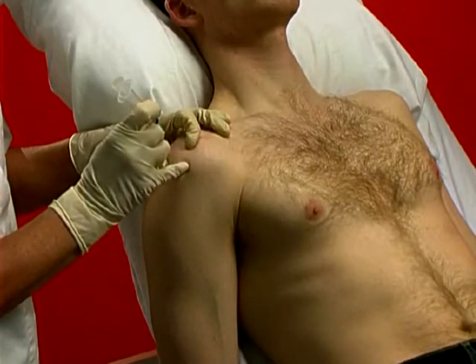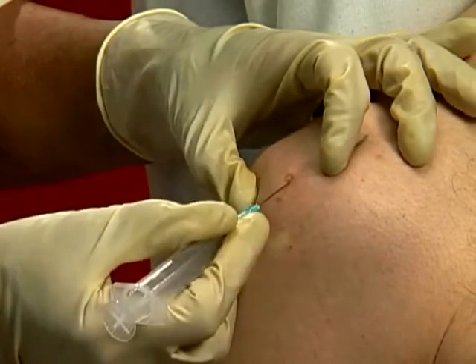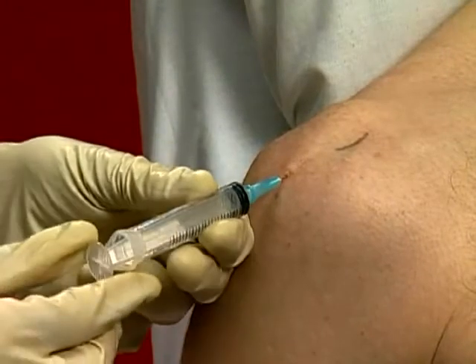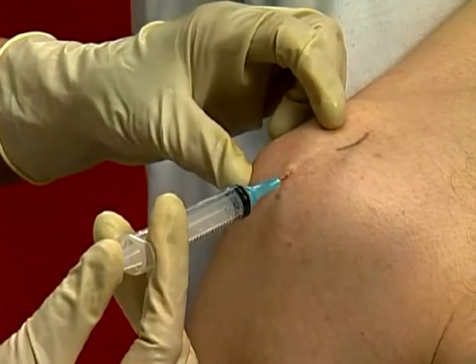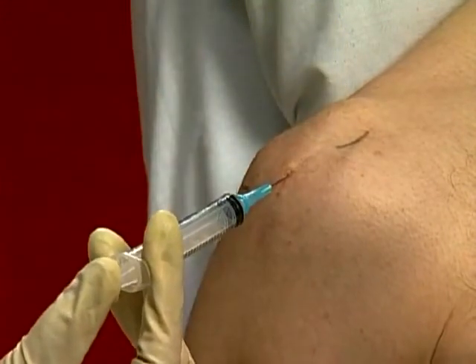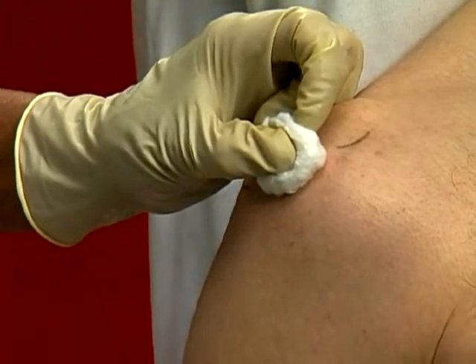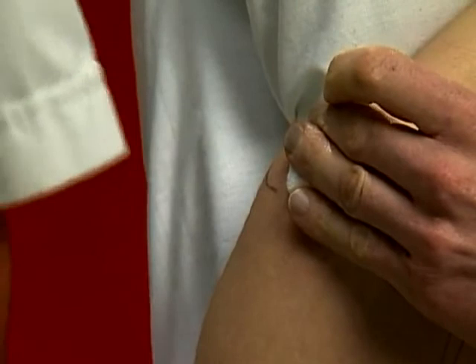Stabilize the injecting hand close to the site, stretch skin firmly and rapidly insert needle perpendicularly. Slowly angle upwards under the acromion. Aspirate, then inject solution while slowly withdrawing. Press firmly around needle with cotton wool and rapidly remove. Dispose of syringe and needle safely in Sharps box.